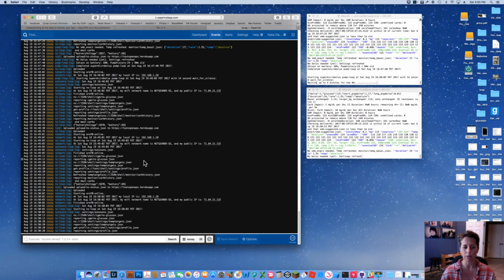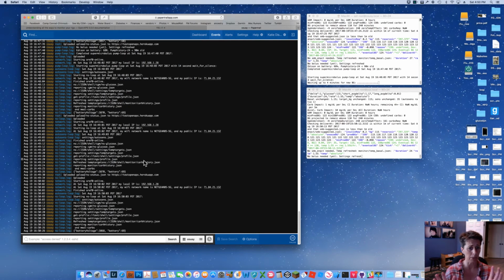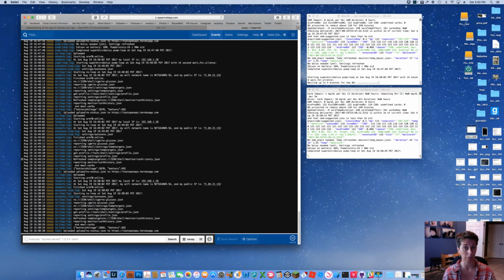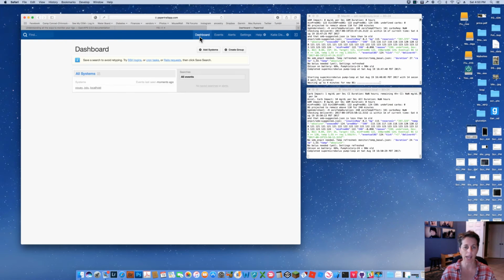So what you want to do is narrow it down so that you're getting to the part that you're really interested in. And this is the big important part. Most of the time that's going to be your pump loop, okay? 99% of the time it's your pump loop. So what you're going to want to do is make life easy on yourself and set up an easy way to get to the important information.